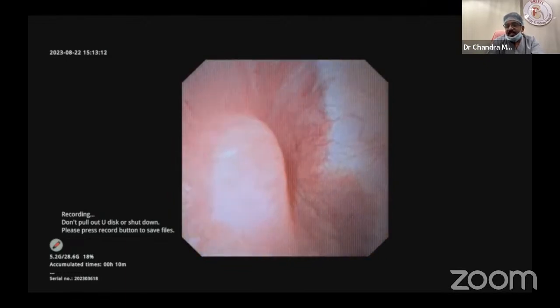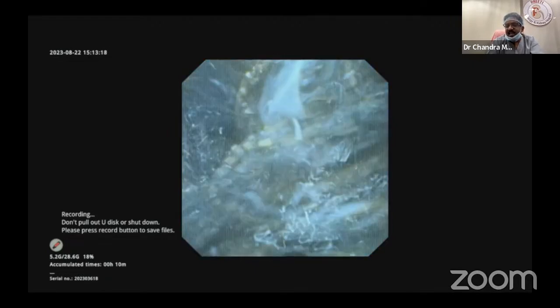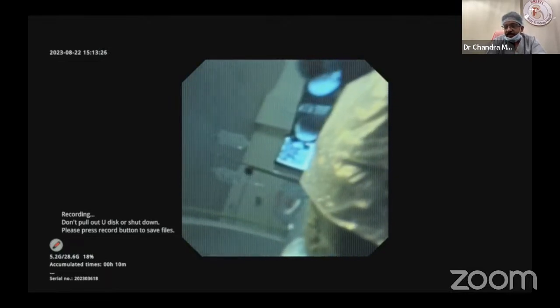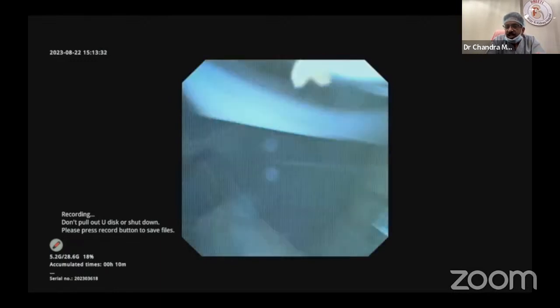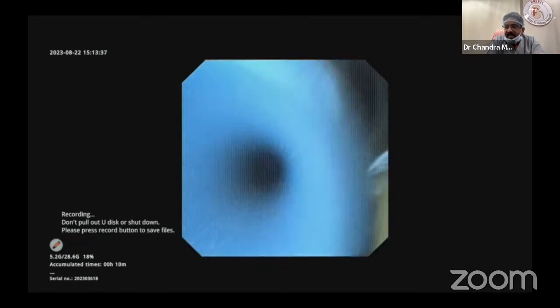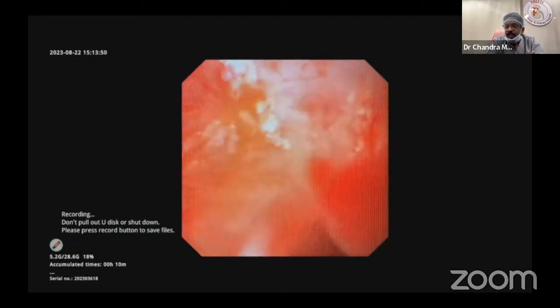In this case, I am not suspecting any stone after so much. So complete clearance is done. It's not a difficult case. It's not a large stone. But for this patient, the aim is to completely clear so that recurrence does not happen. If you want to check, you can inject contrast from below and check. But that is only for academic purposes. Contrast usage in children must be lessened. Come out. At this stage, I should come out actually. I should not do anything more in this case. But out of enthusiasm for this class, I have injected contrast and shown the inferior calyx again.